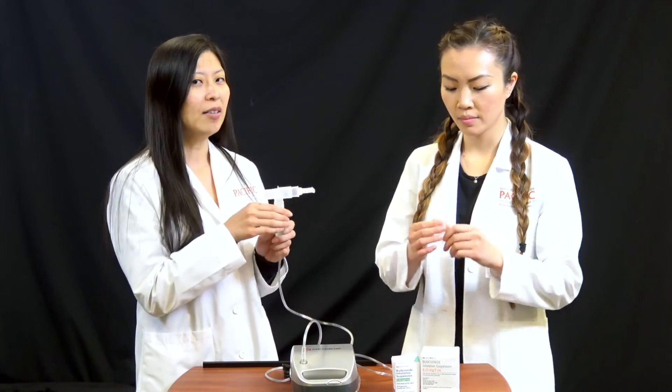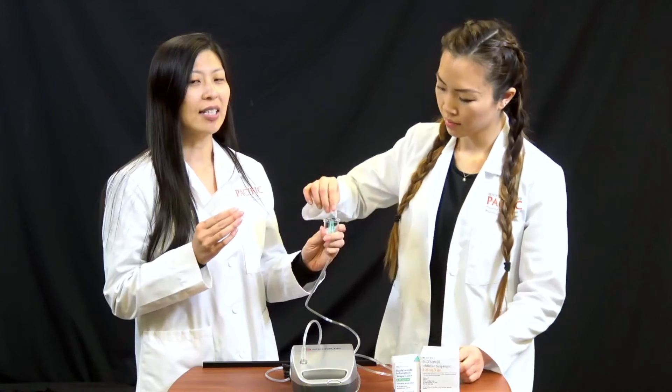Place your nebulizer on a hard surface and plug in your nebulizer. Connect the tubing to the compressor and to the bottom of the medication cup. Twist the ampoule open and add the medication down the side of the cup.